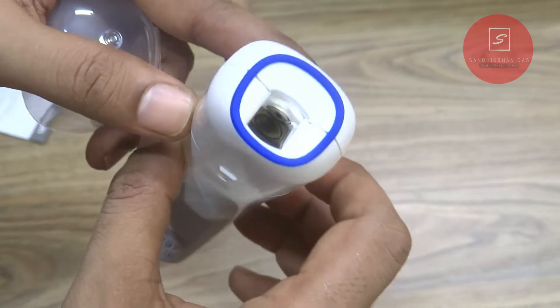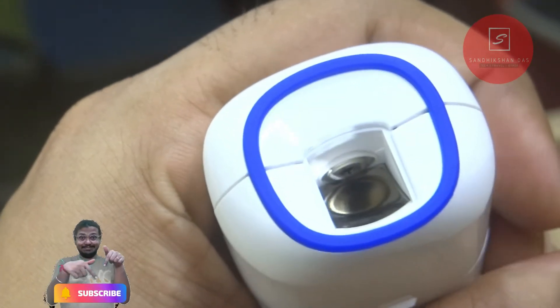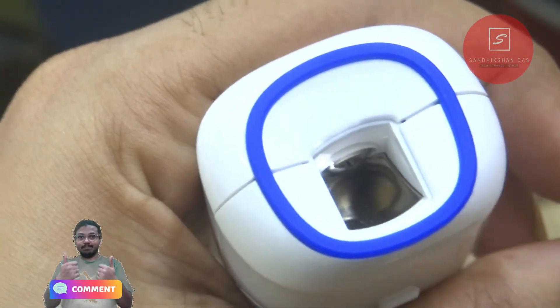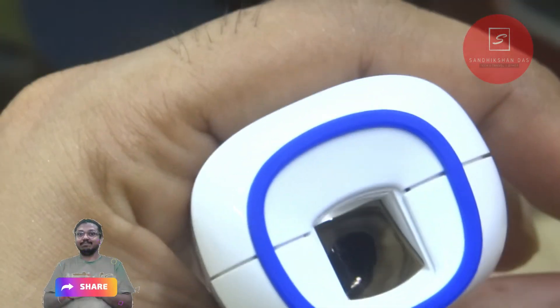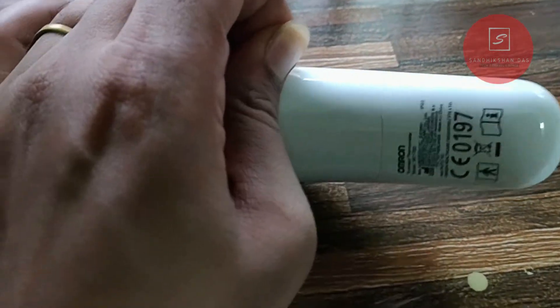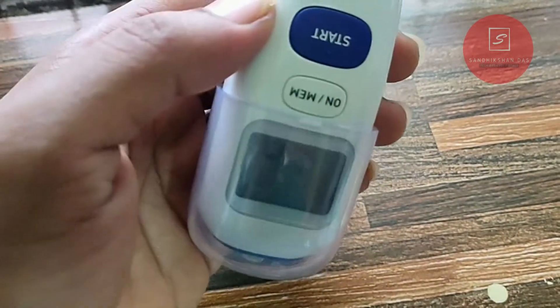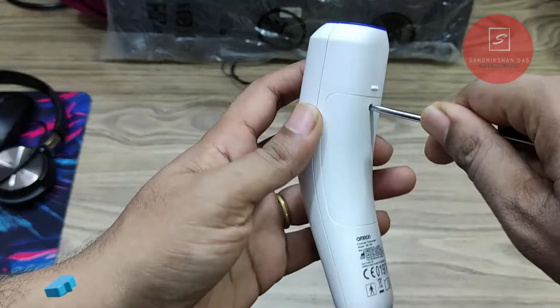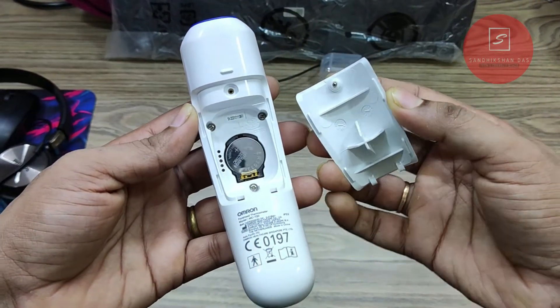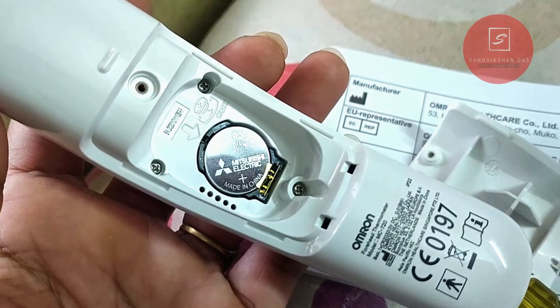If your lens gets dirty, clean it with a soft 70% alcohol-moistened cotton swab pad. Let it dry for 2 minutes, then use again. Don't use any water, liquid, chemical, tissue paper, or paper towel to clean the lens area, as that will damage the lens. If you are using it for the first time, you will have to pull the insulated tape out from the battery compartment. In future, if you need to replace the battery, unscrew the battery lid. It uses a 3V CR2032 battery, which lasts for more than 2,000 readings.